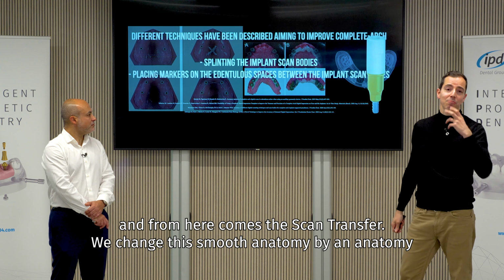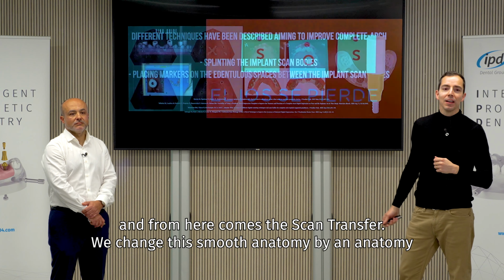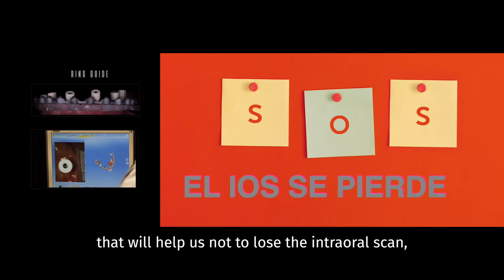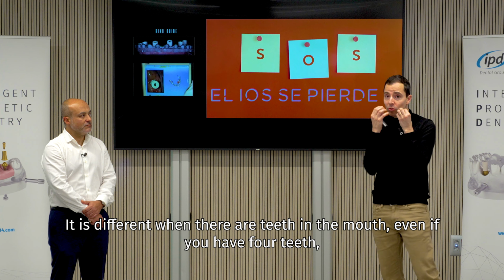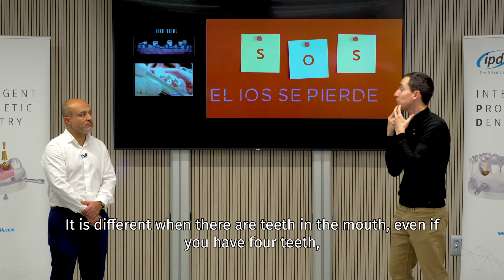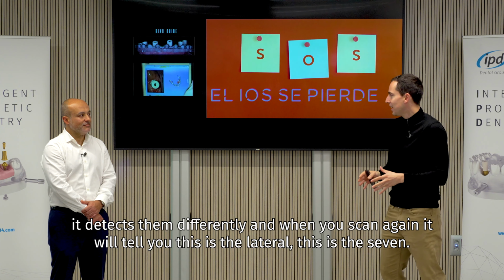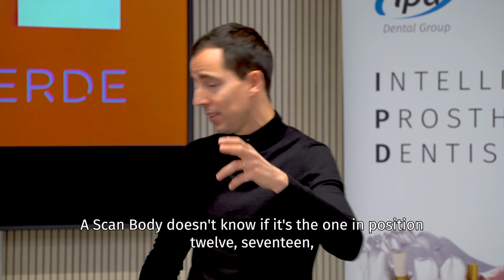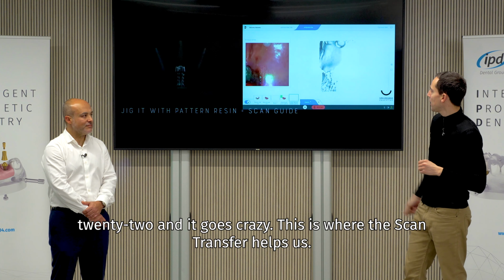And from here comes the scan transfer. We change this smooth anatomy by an anatomy that will help us not to lose the intraoral scan, because the scan bodies are all the same and the scanner cannot differentiate. It is different when there are teeth in the mouth. Even if you have 4 teeth, it detects them differently. And when you scan again, it will tell you this is the lateral, this is the 7. A scan body doesn't know if it's the one in position 12, 17, 22, and it goes crazy. This is where the scan transfer helps us.